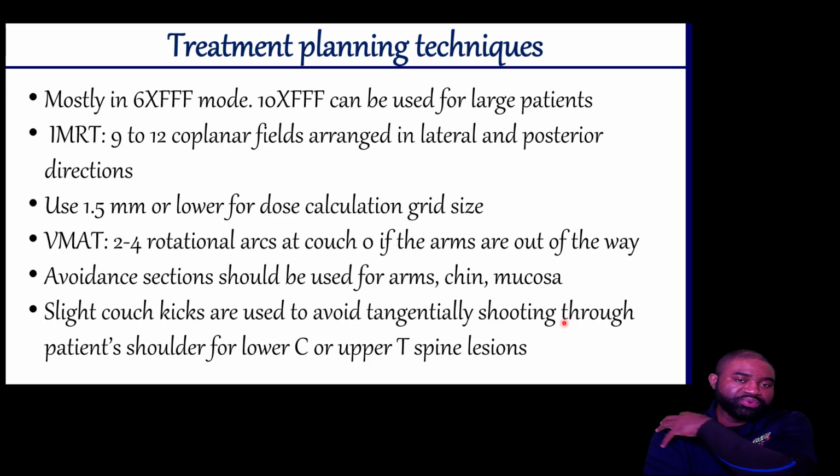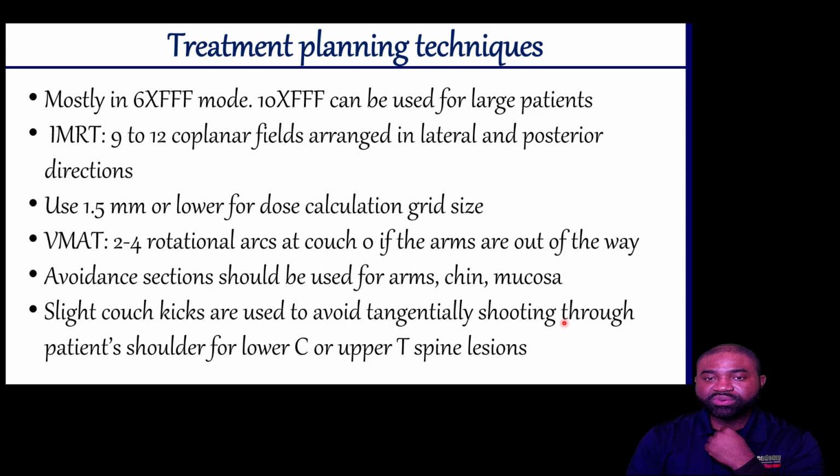Because the beams will go through the shoulders, it will increase the attenuation of the beam, which in turn will decrease the accuracy of our dose calculations.